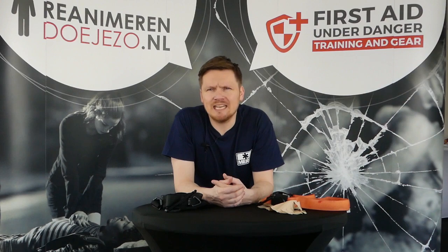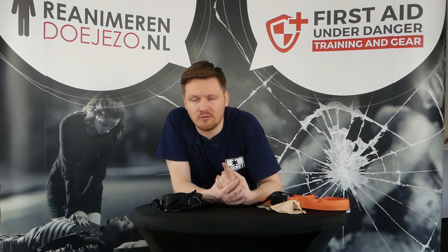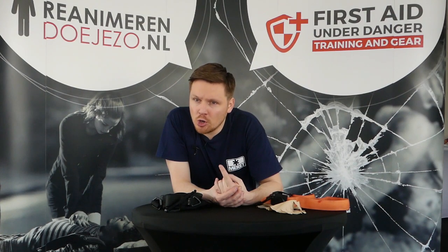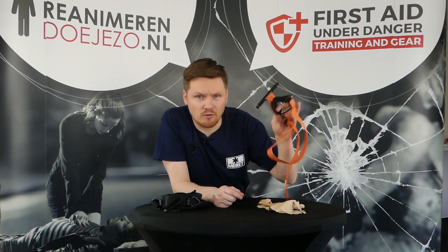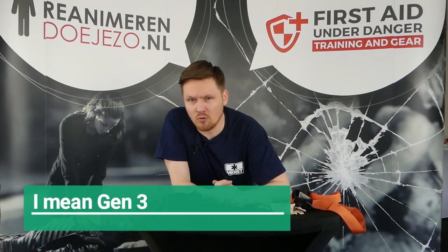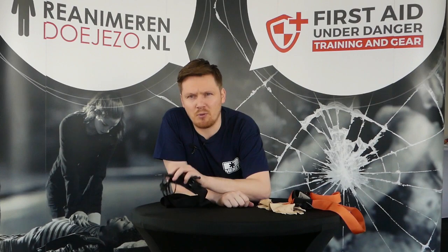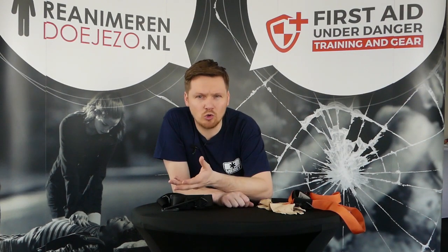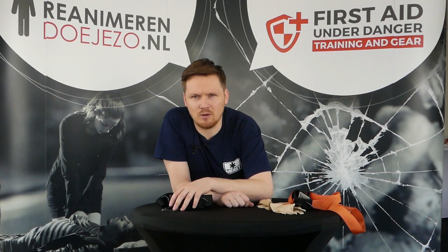Is it as easy, as simple, or user-friendly? That is the right word. Is it as user-friendly at the moment as the Combat Application Tourniquet? Not in every regard, but in much more than it was with the SOF Generation 3. So it might be that in the near future we're going to swap around the Combat Application Tourniquet for the SOF during our practices, but I first need to find out if I'm just doing it the wrong way, or is it really true that we need more training for people to be able to do it as quickly as they can with the CAT.